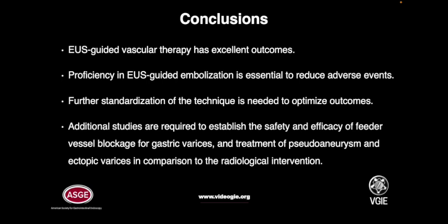Finally, to conclude, EUS-guided vascular therapy has excellent outcomes. Proficiency in EUS-guided embolization is essential to reduce adverse events. Further standardization of the technique is needed to optimize outcomes. Additional studies are required to establish the safety and efficacy of feeder vessel blockage for gastric varices and the treatment of pseudoaneurysm and ectopic varices in comparison to radiological intervention.